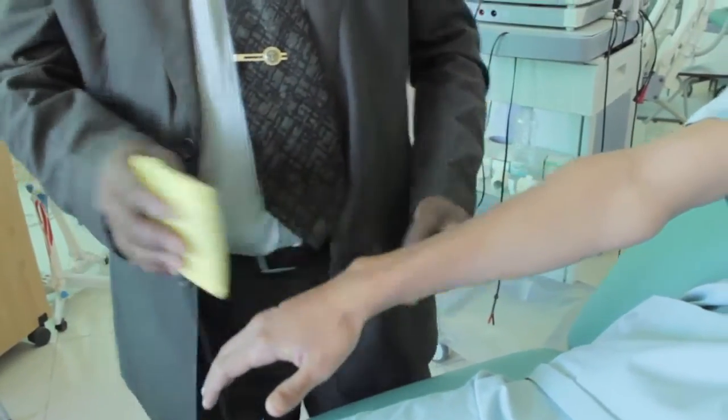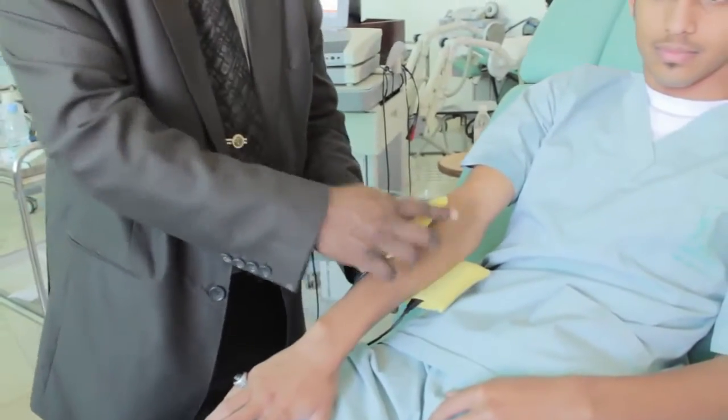The problem with big electrodes is when you are using electrodes, Shabab, this applies for all the electrotherapy equipments. When you use electrodes, they cannot touch each other. Okay? If they touch, what happens? Not shock. It is not shock. The patient doesn't get any current.